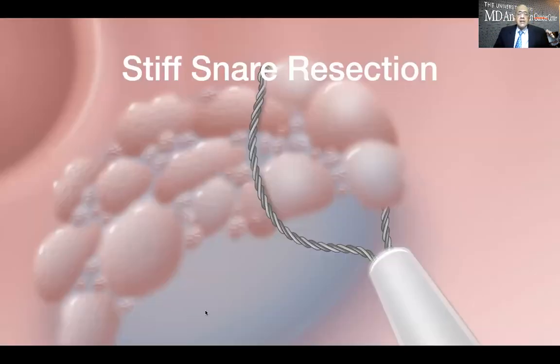I prefer to use a stiff snare for all my endoscopic mucosal resections. I typically use in the cecum anywhere between 10 to 15 millimeter snare. For those of you who are starting, if you want to play safe, take a smaller snare, a 10 millimeter snare, and you will come out good with fewer complications. It may take a little longer, but you could easily cut it.